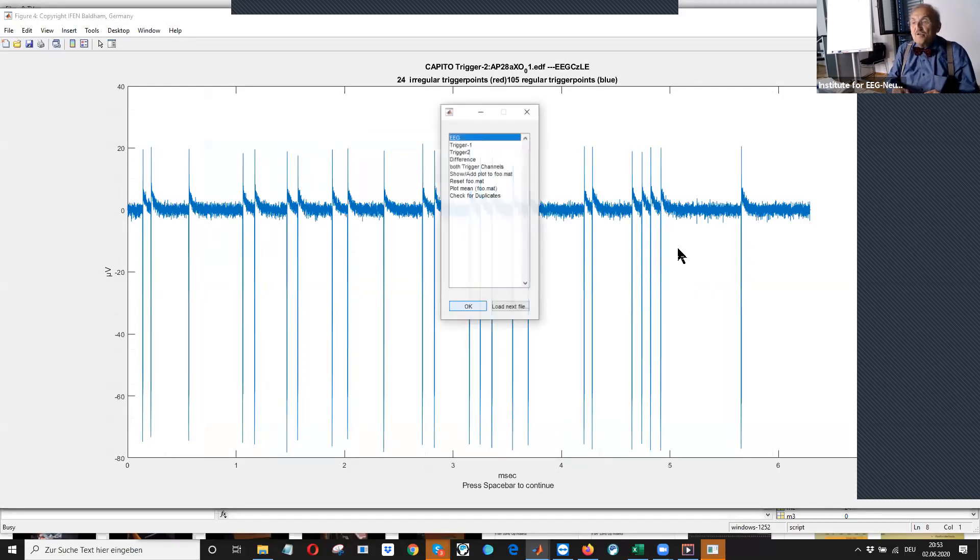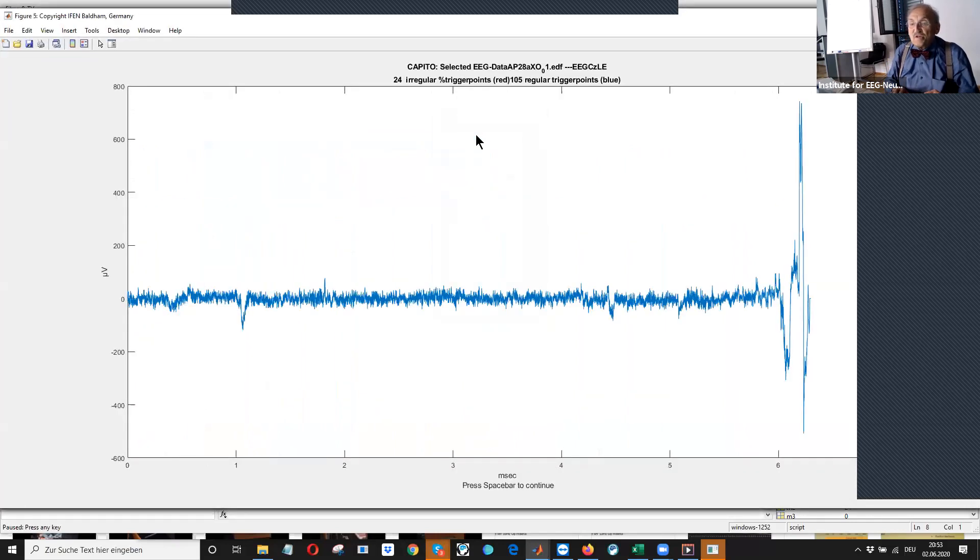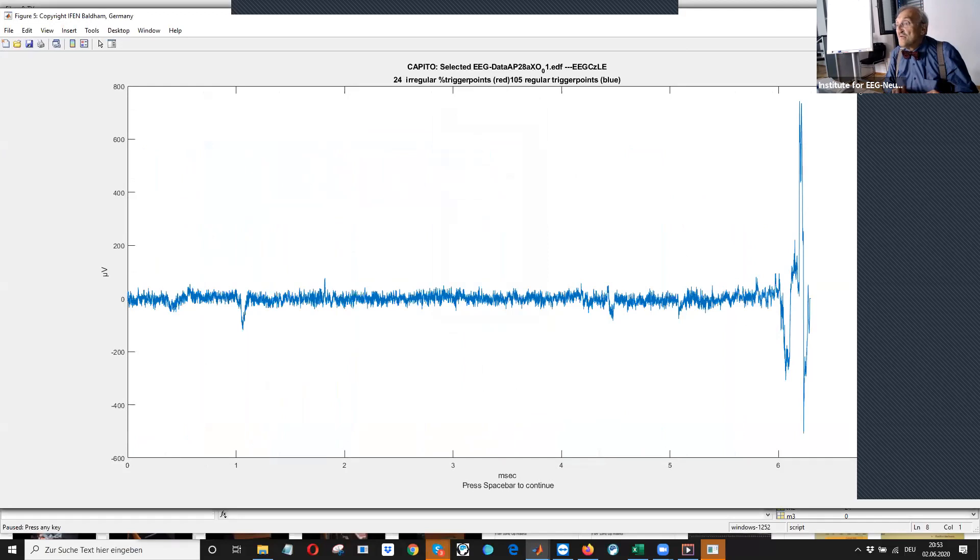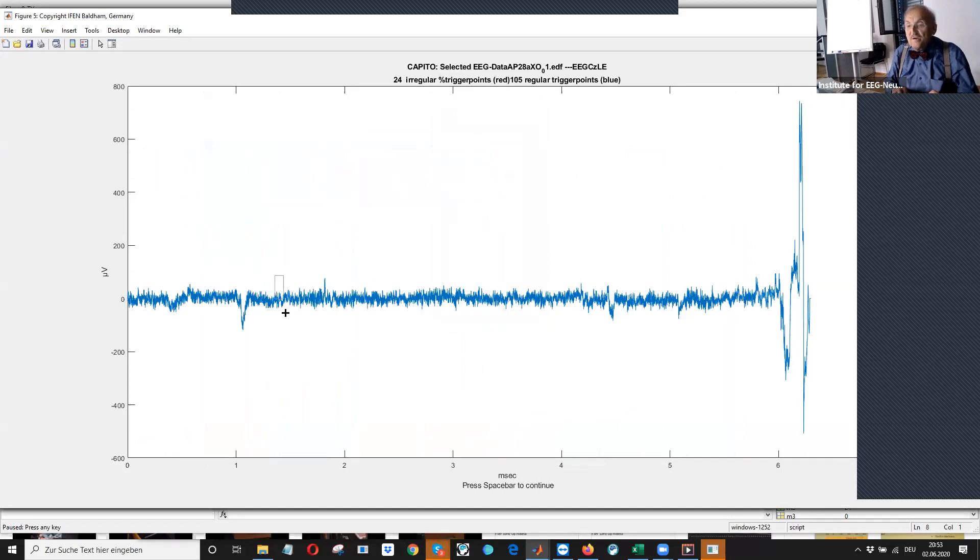we also can have a look to the EEG itself. What was recorded? I can magnify it also to look at about one second. How was the quality of the EEG?